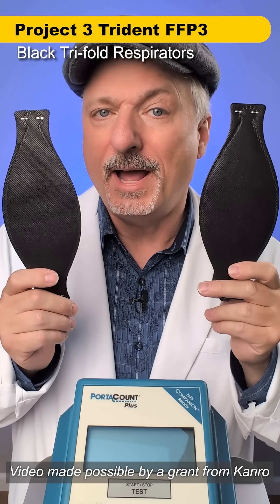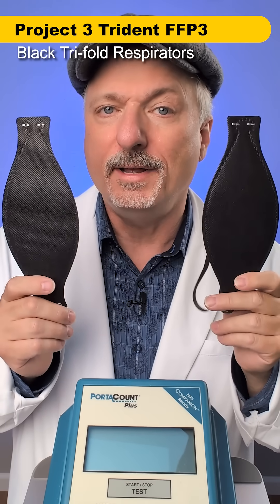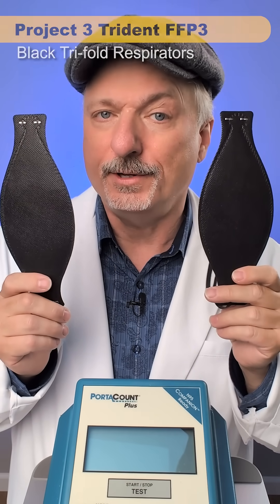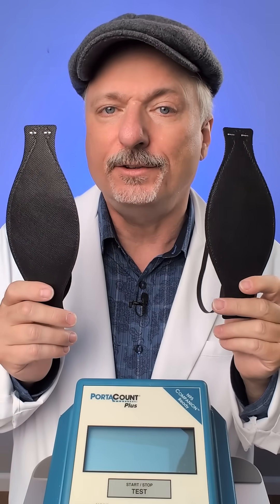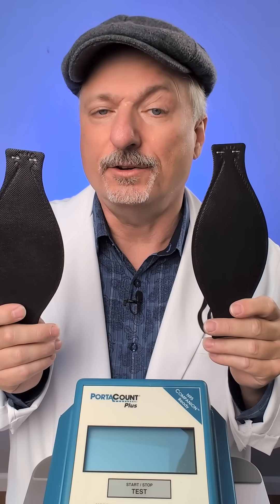If you are looking for a nice looking black tri-fold respirator that doesn't compromise on performance or quality, these Project 3 Trident Tri-Folds might be the ones for you. They come in a bunch of different sizes, and the regular size comes in two different strap lengths, depending on how big your head is or how tight you like your straps.